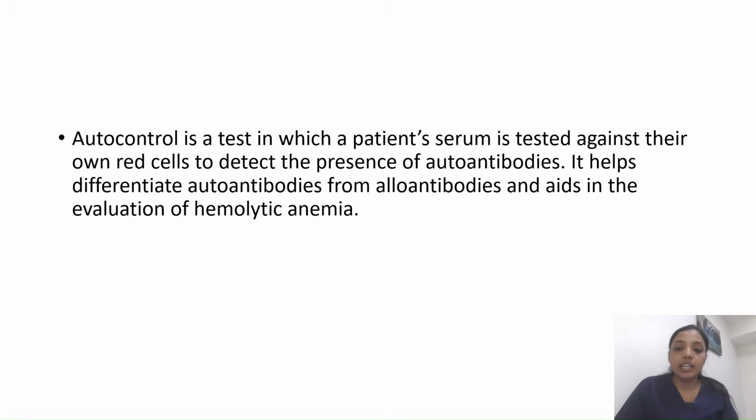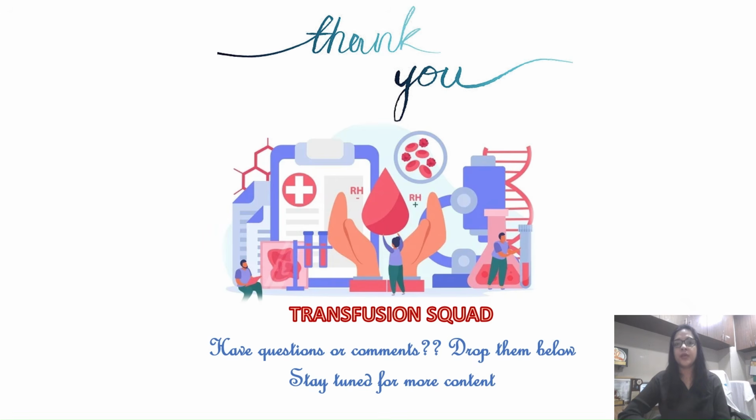The clinical significance in patients are: first, the main primary thing is it helps in differentiating alloantibodies from autoantibodies, helps in the investigation of hemolytic transfusion reaction, is majorly used and helpful in the workup of autoimmune hemolytic anemias, and also evaluating pan-agglutination reaction.